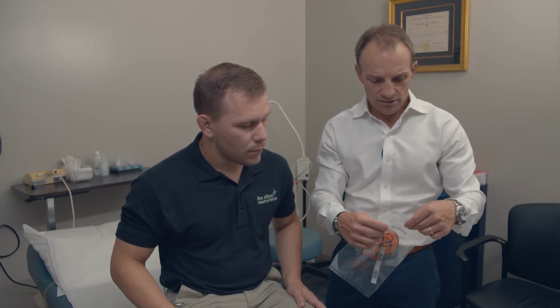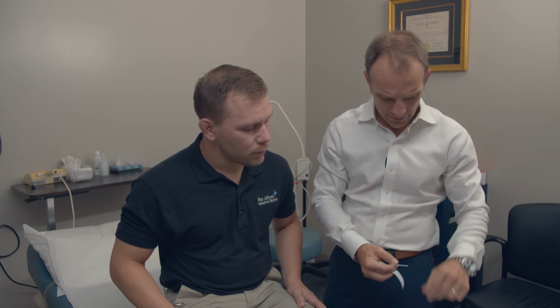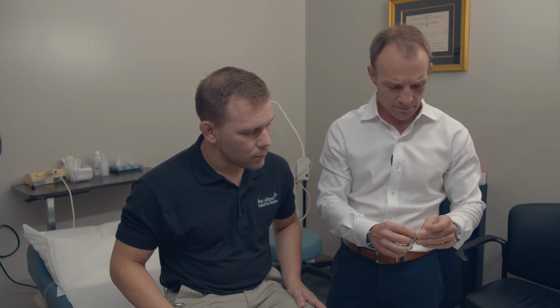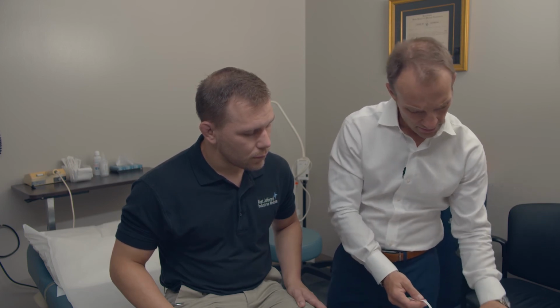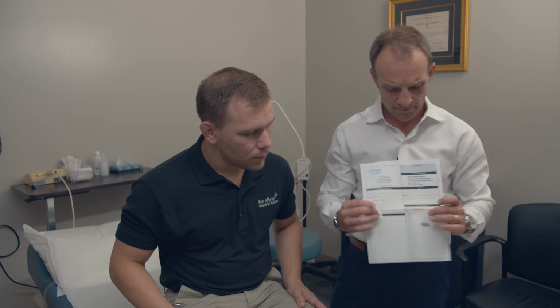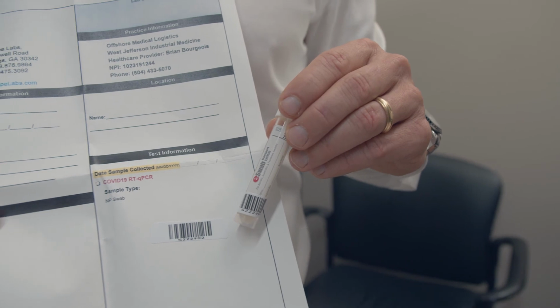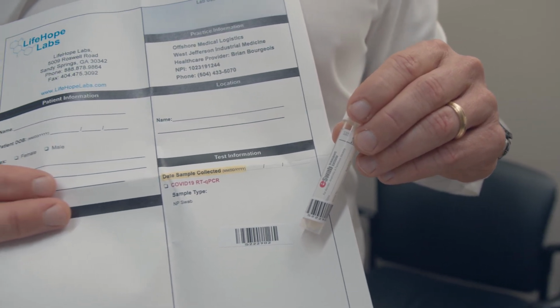The last portion that you're provided with is a label. There are two bar-coded labels on here. One label is going to go on the collection vial. The second label is going to go on the paper like so. I would just get you to check both numbers match. It's always a good option.